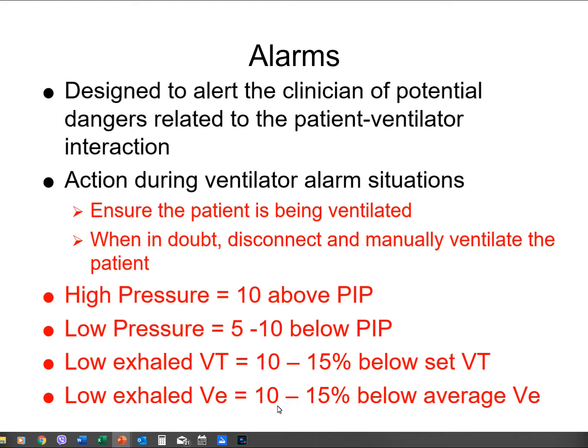So if I pick the low end at 5, I subtract 2, that's going to be 3 liters a minute, and that's pretty low, but it's still a bit sustainable for the patient. So when they hit 3 liters, it alarms. I can go in there and adjust and get that minute ventilation back. Okay, so that's what we're going to use with our alarms.